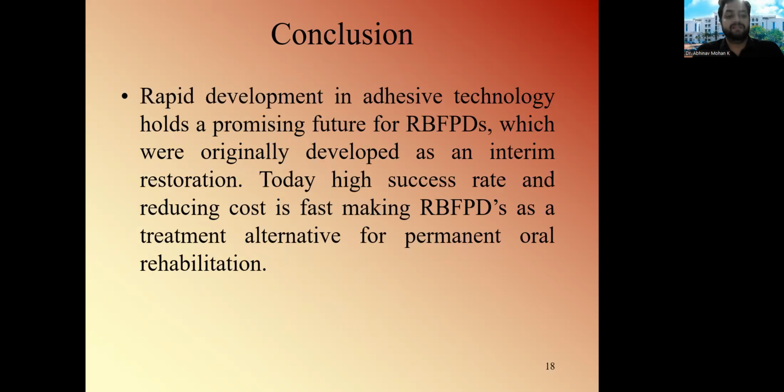So finally, the rapid development in adhesive technology is what holds a promising future for your resin bonded FPDs. It was originally developed as an interim restoration. Today, because of its higher success rate and reducing costs, it is fast making its way as a treatment alternative for permanent oral rehabilitation.